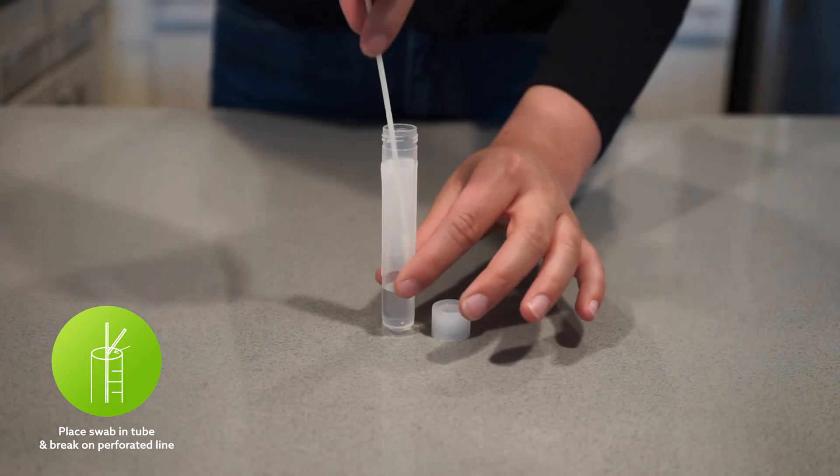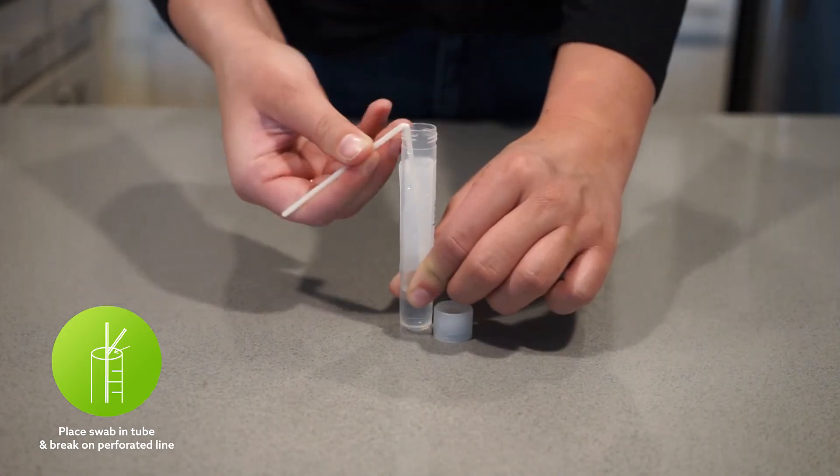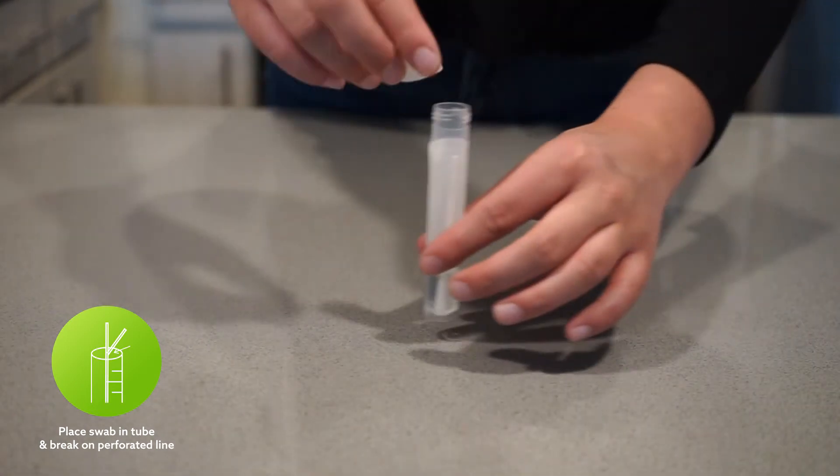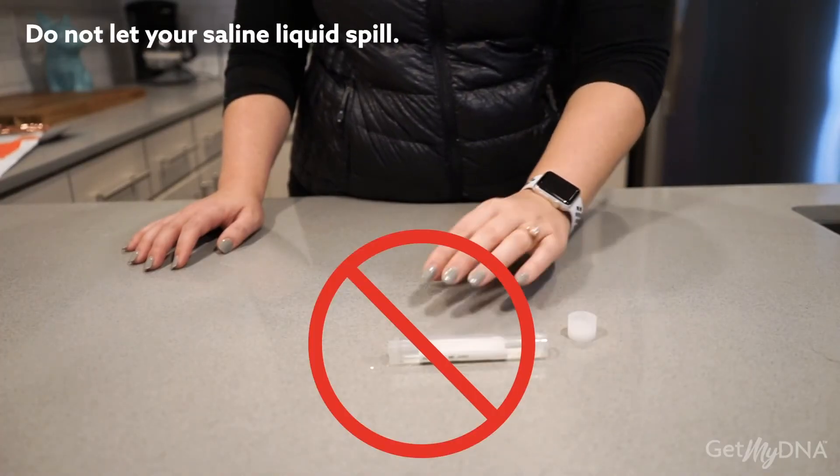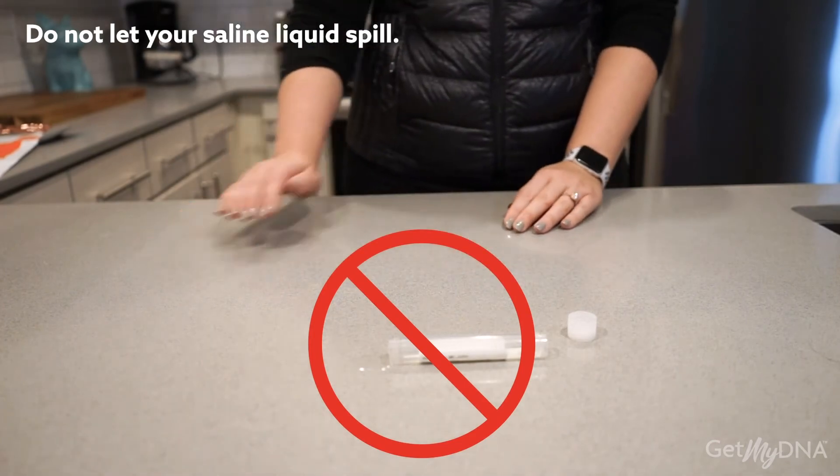Place your swab tip down into the tube. Break your swab on the perforated line and securely close your tube. Make sure not to spill your saline liquid, as doing so can lead to a potential false result or no result.